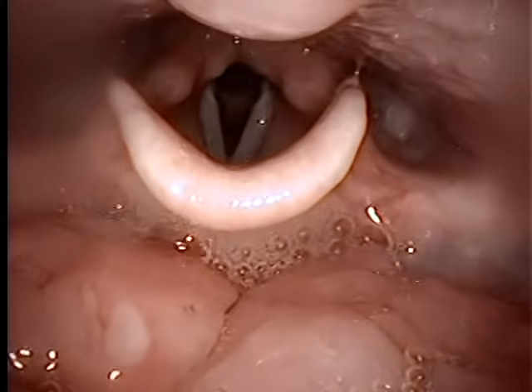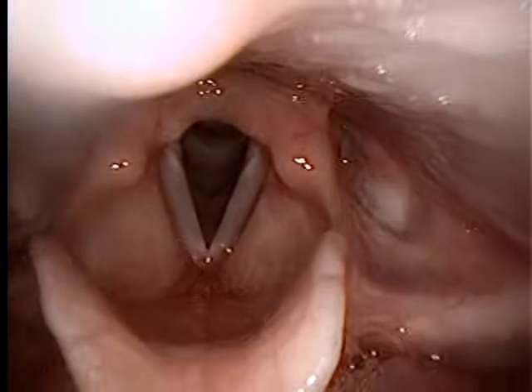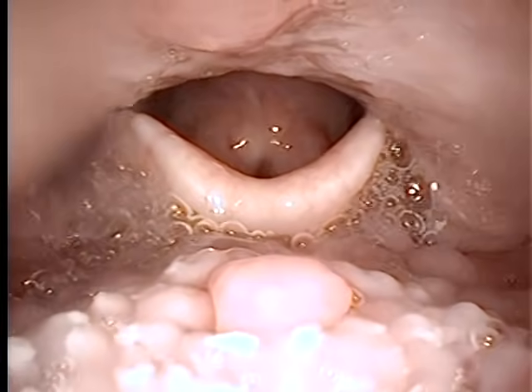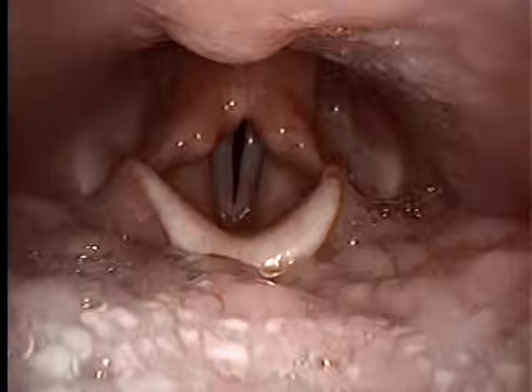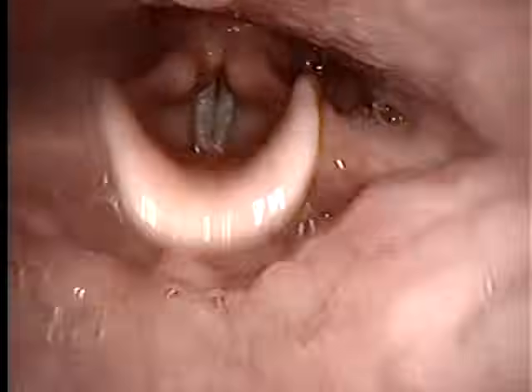If you do it again, do it without the belt. Ah, ah, ah. See a lot more of the tongue. Ah, ah. Yeah, I can't really belt without it.